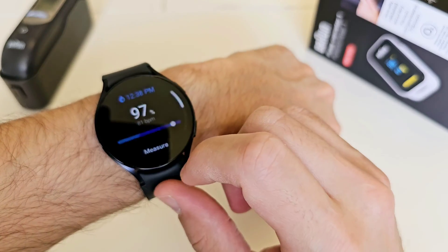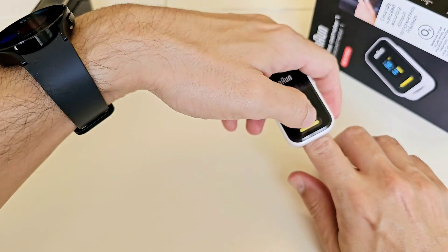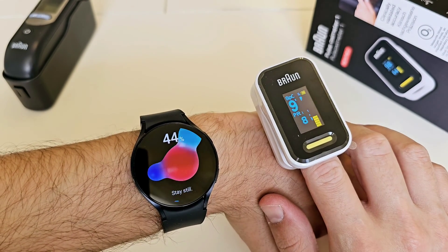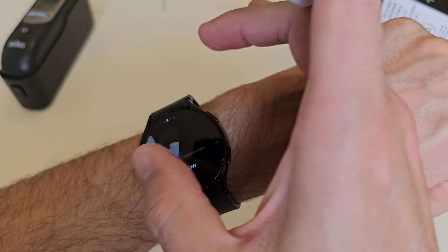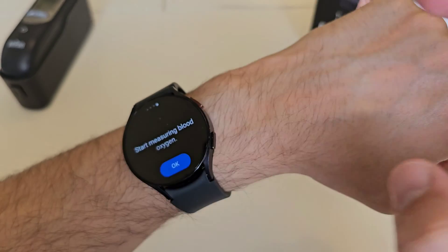We're going to start the test right now. Let me start this one as well. You have to place your elbow on a table and hold your wrist near your heart, and then start measuring blood oxygen. Let's go ahead and measure it.